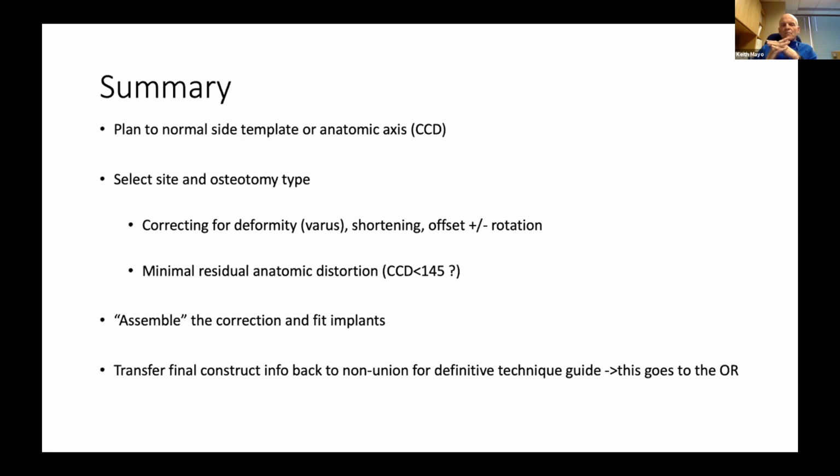And so once you're done with those, and you assemble the correction and fit the implants, and then transfer that construct back to the original deformity, that set of drawings or set of images goes to the OR and goes up before the case starts, so that everybody in the operating room understands the sequence that you're going to follow. So with that, thank you very much.